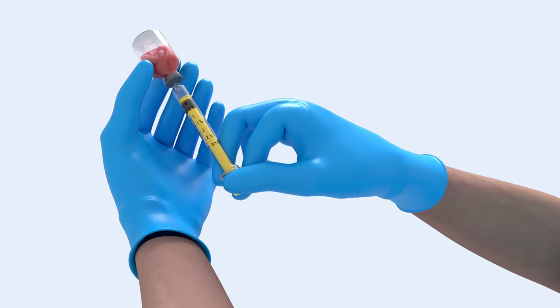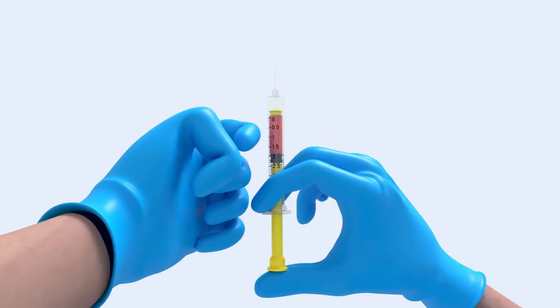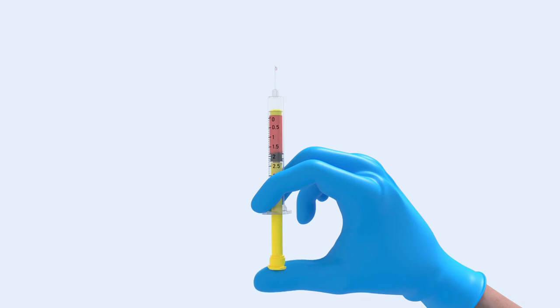Invert the vial and draw up the medication required. Add a little to compensate for any air bubbles. Tap syringe sides to bring any air bubbles to the top. Expel excess air from the syringe.